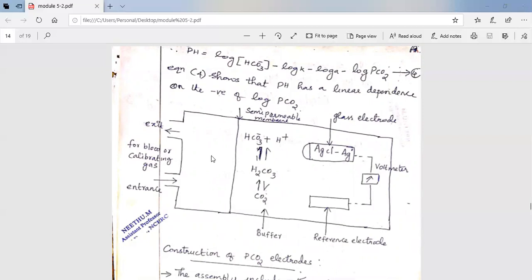When the specimen is placed in the chamber, CO2 diffuses across the membrane to establish equal concentration in both chambers. If there is a net movement of CO2 in or out of the chamber, the pH meter indicates this change, and this change is noted.